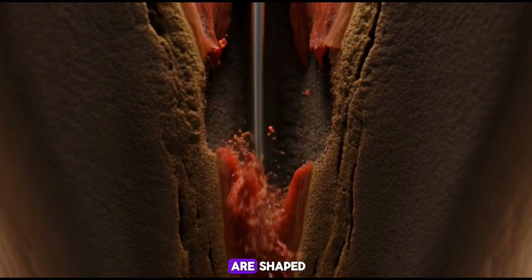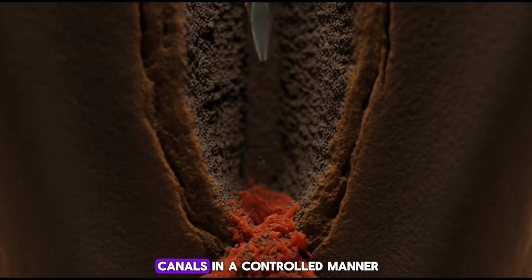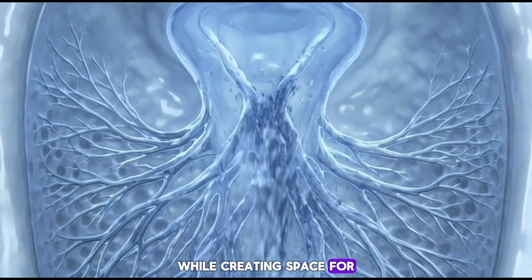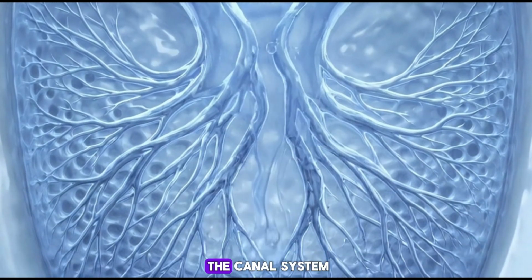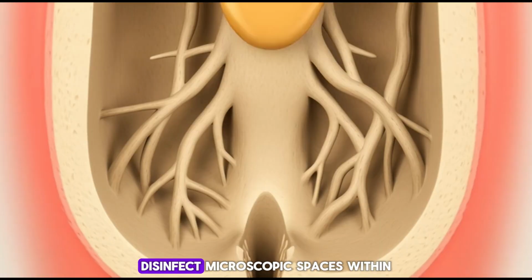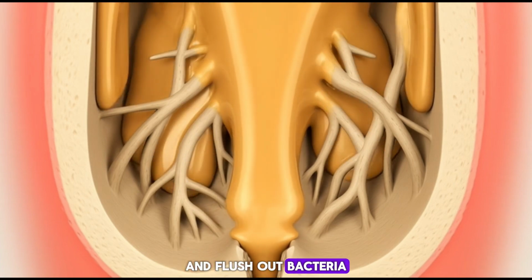Next, the root canals are shaped. Flexible nickel-titanium rotary files enlarge and taper the canals in a controlled manner, preserving natural curvature while creating space for effective cleaning. Throughout shaping, irrigating solutions flow through the canal system. These solutions dissolve organic debris, disinfect microscopic spaces within dentinal tubules, and flush out bacteria.